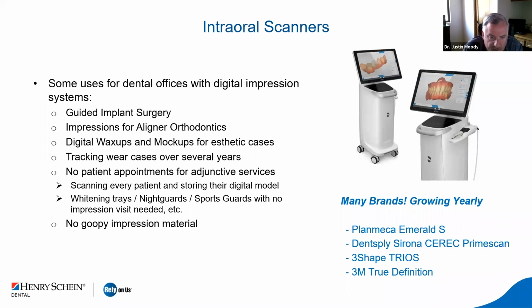I don't do every single implant surgery with a surgical guide, but for every one of my patients, I have that data so that I can make that choice on my own on whether it's going to be freehand or guided, or sometimes when guided surgery is not indicated in those areas. And of course, we don't have any of that goopy impression material, which is a plus for a lot of our patients.